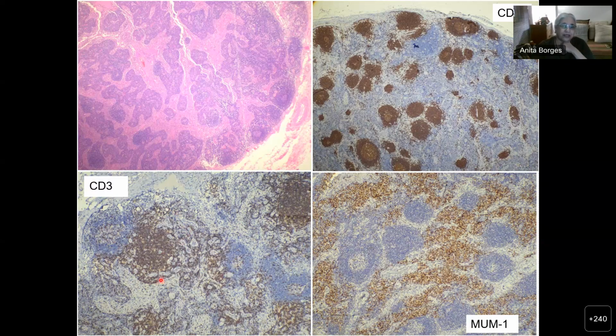They're actually blood vessels, the high endothelial venules in the T zone, which are obviously not picking up CD3. You see them stand out as a negative structure. Just notice that the area that was CD20 positive is negative, except for here and there a few CD3 positive cells in the germinal centers. So now you are able to see the cortex, which is this area, and that which is the T area, the paracortex.